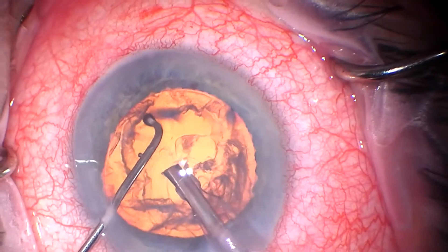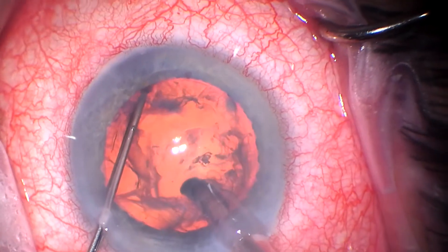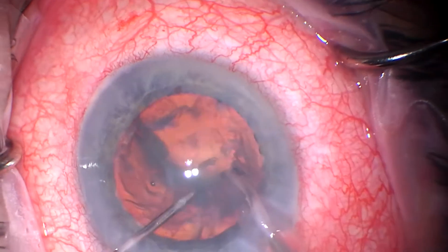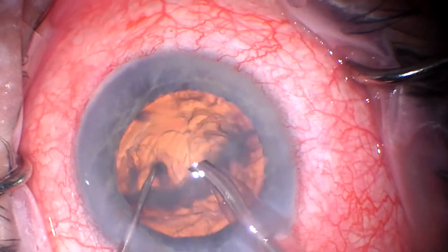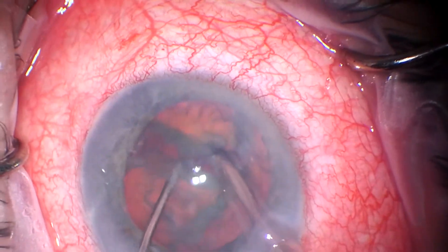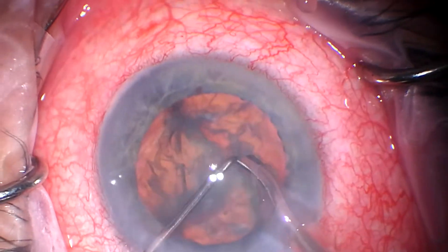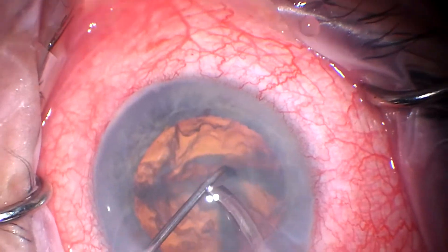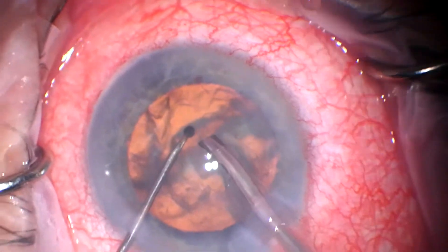And I thought that looked good, so here we'll do a horizontal chop phaco. I suppose it may be noteworthy that I do the Hydrus kind of in the middle of the cataract procedure. People talk about whether you do it at the beginning or at the end, and I like to do it in the middle. I find that there's a good balance of maintaining a good view and completing some of the critical steps of the phaco before the implantation.